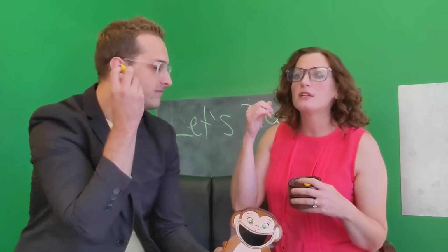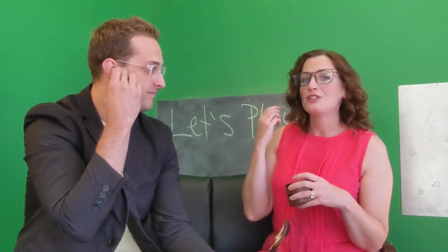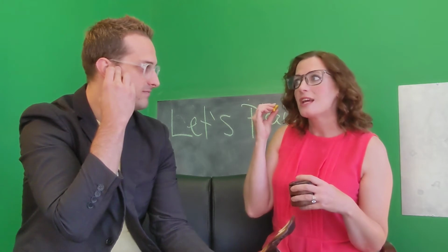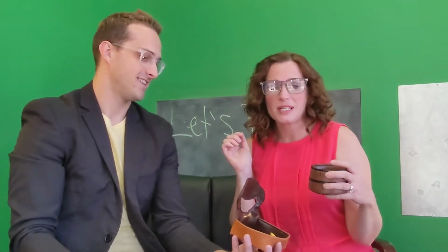So I'll give the toy to the child, and I'll say, okay, put that up to your ear, listen really closely, and whenever you hear that birdie sound, you're gonna feed the monkey. So we'll do a practice round, and I will actually vocalize, okay, let's listen, JJ. Wah, wah, wah, wah, wah. We heard it! And so we get to feed the monkey.